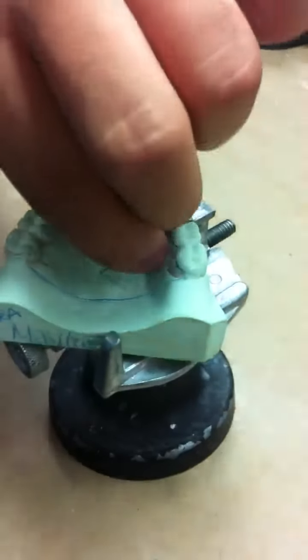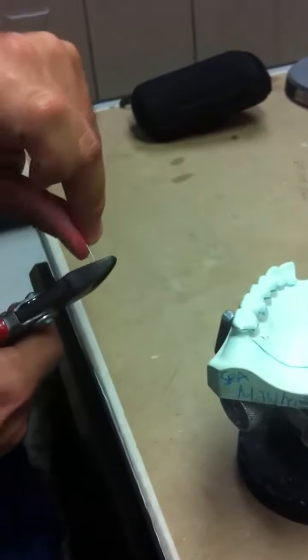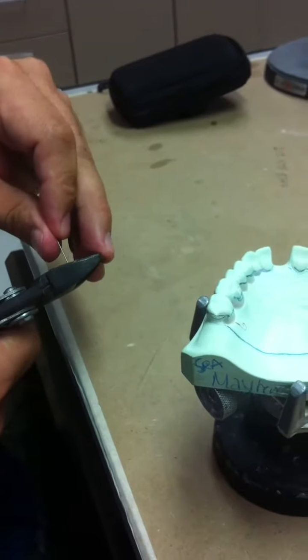With it touching the palate, we are going to have to trim and cut away the excess metal.